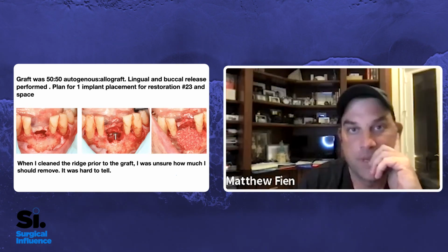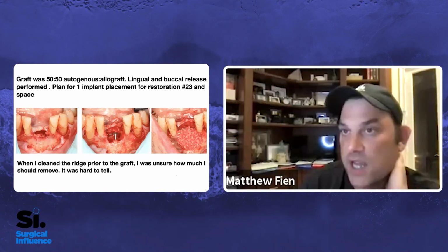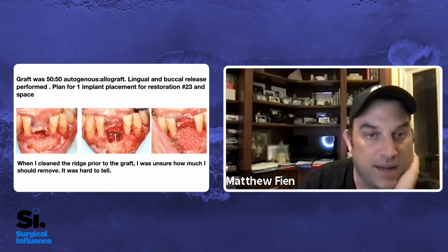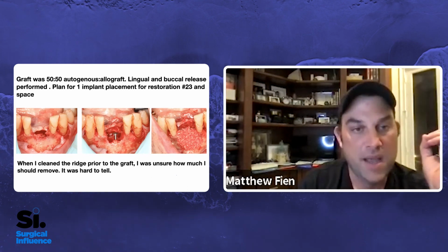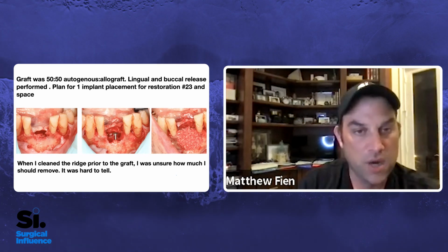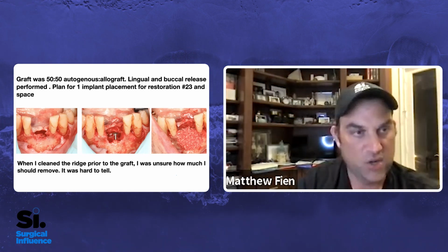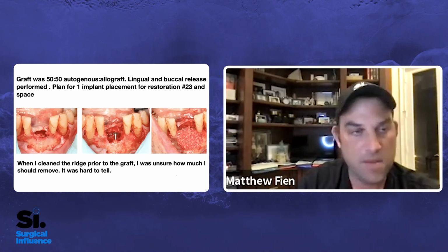Yeah. And I'll say here, it's hard for us to tell if they used PRF here or if it's just autogenous scrapings, but a great area to harvest some autogenous locally. I like the incision design in regards to the fact that we know where the mental foramen is, and having that access, having those verticals, is going to allow you to get primary closure. I would say maybe I would have placed them a little deeper into the vestibule. But look how that bone is staying so nice and tidy there. So I'm guessing there was just a good amount of autogenous there, or maybe even sticky bone.